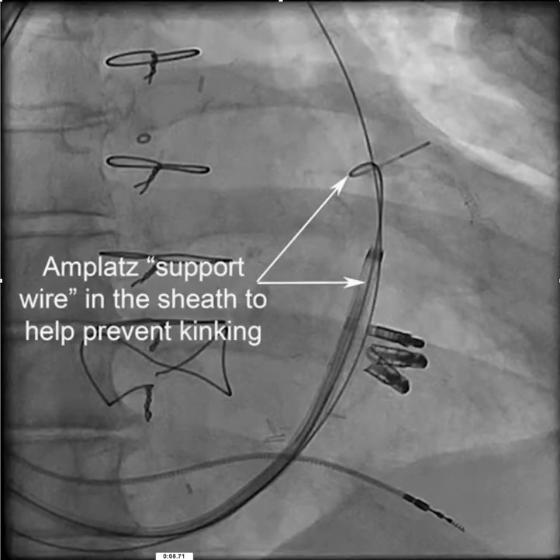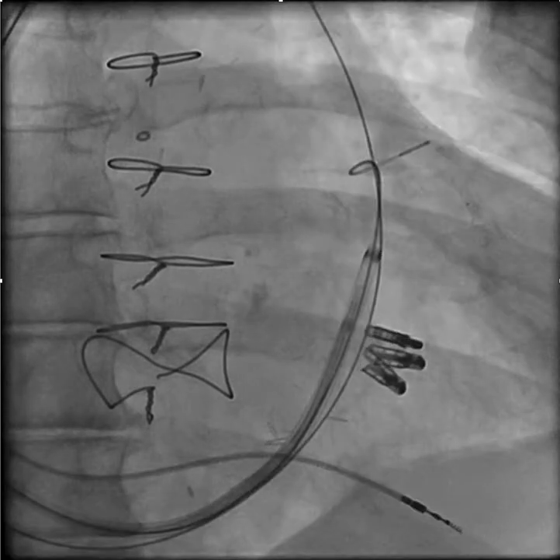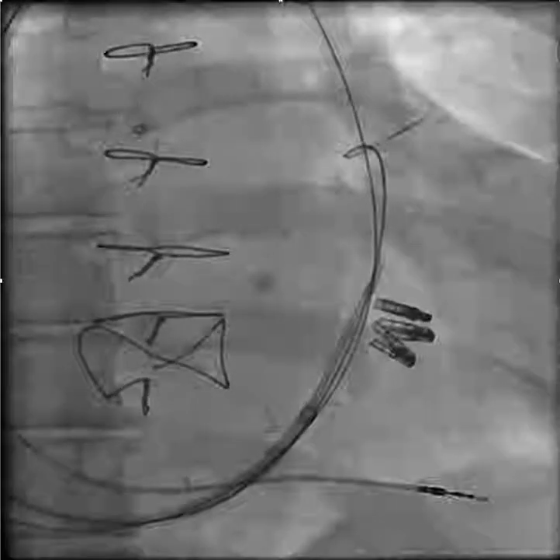To overcome the problem, we put in an Amplatz support wire inside the sheath — this helps the sheath stop kinking if there are any bends up in the subclavian. We also put in an Amplatz buddy wire beside the sheath. You can see it's separate here, running alongside the sheath up in the subclavian, hopefully straightening out that tortuous area we showed you.